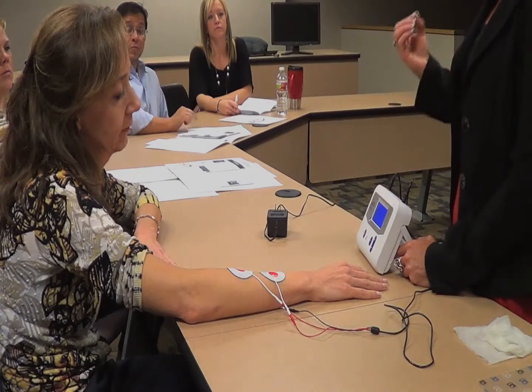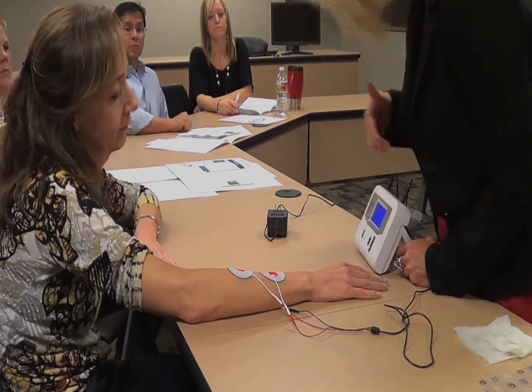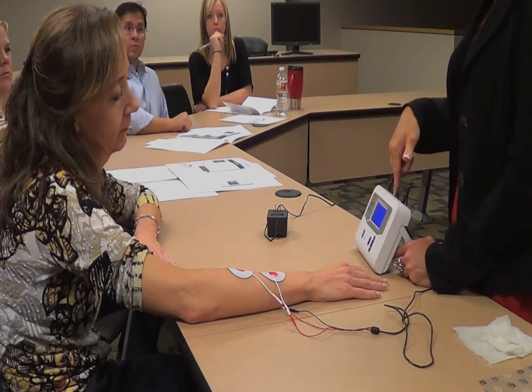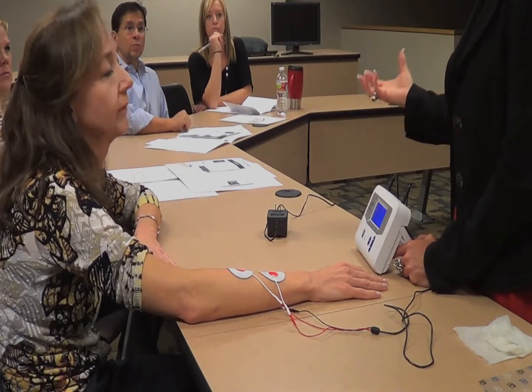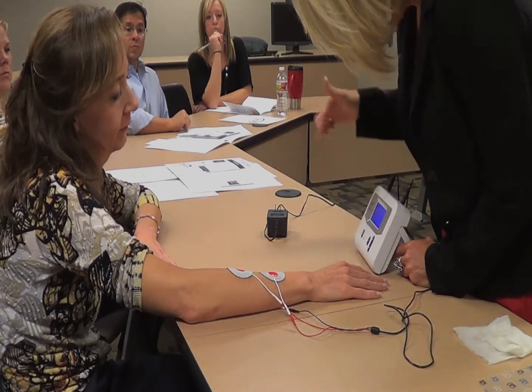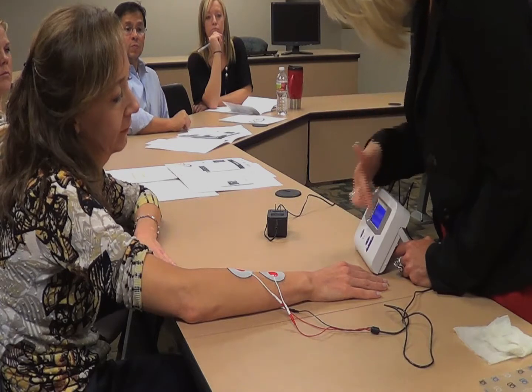Here's where you pick the mode. So it's in stroke rehab mode. If you hit the arrow up or down, it'll get you into the next, which I'm in the stim only mode right now, so that's turning the EMG part of it off, so you wouldn't be able to actually engage the NeuroMove in the neuroplasticity process, or the spinal cord injury mode. So this is where you would do that.